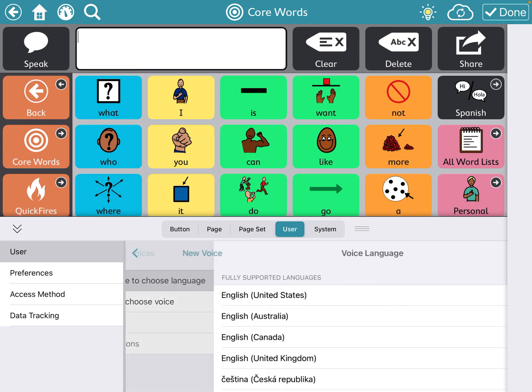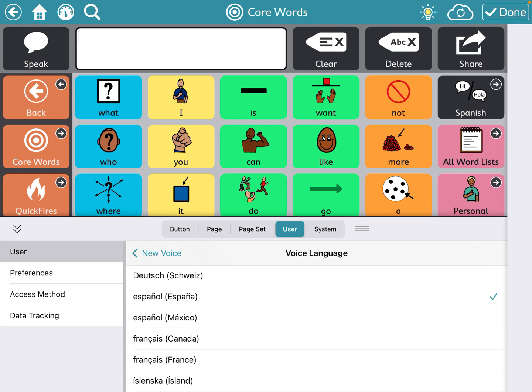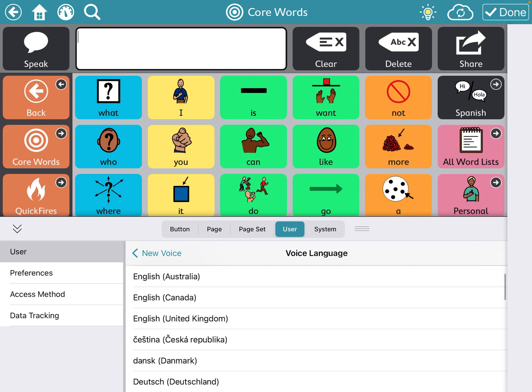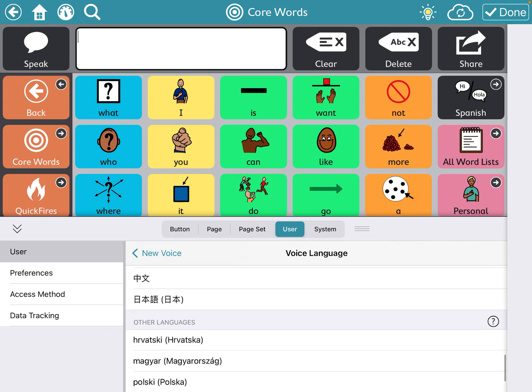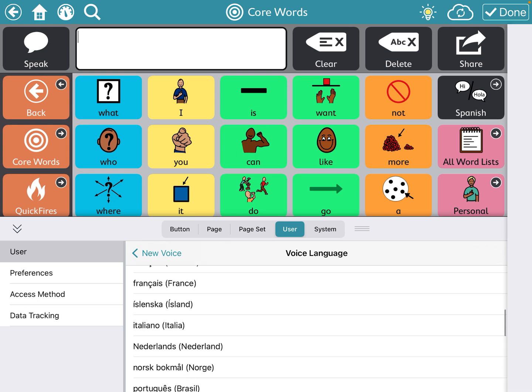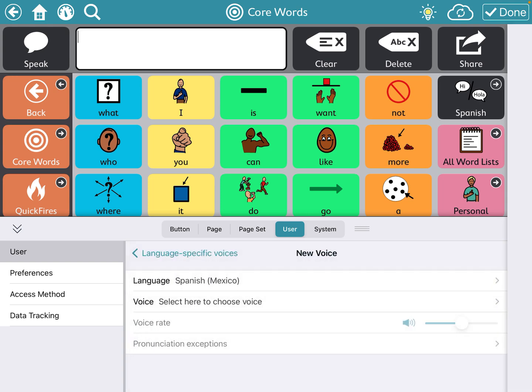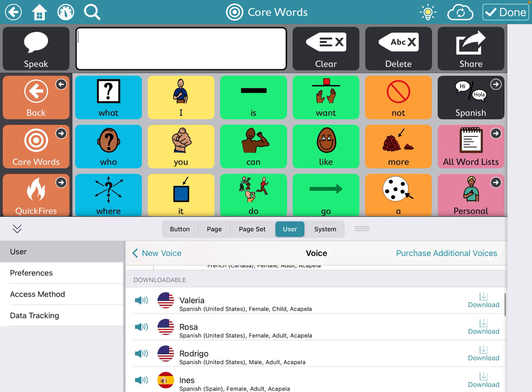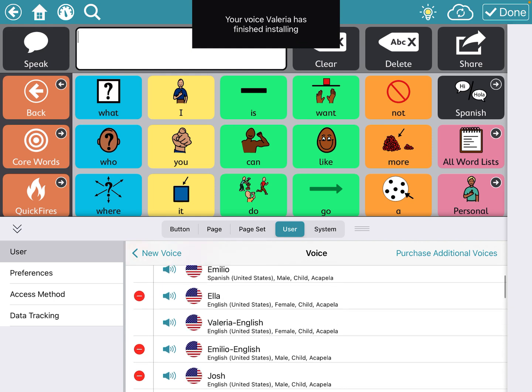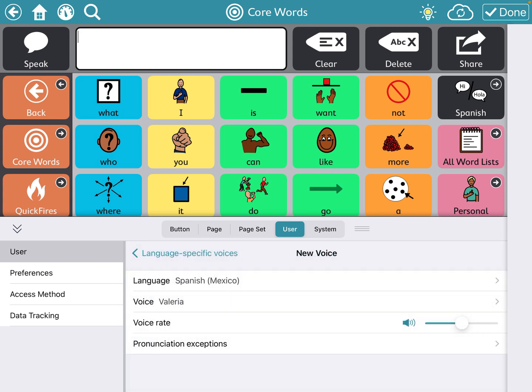Select a language — there are a ton of choices, but I'm going to find Español, Mexico. Go to the voice choice and you'll see a lot of different options. You can see that Valeria has a Spanish option, so download that one. Press on Valeria Spanish — make sure it's the Spanish one and not Valeria English. Go back to New Voice and that should be set up.